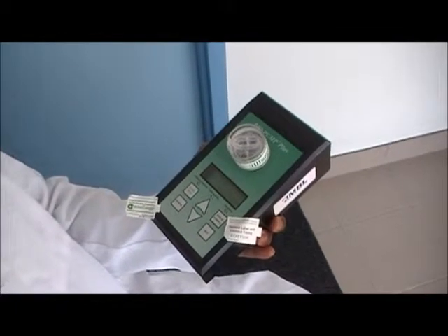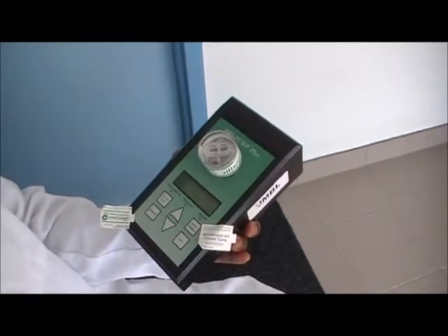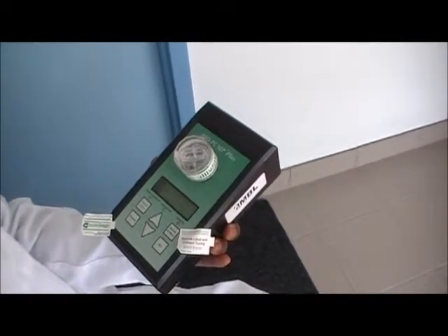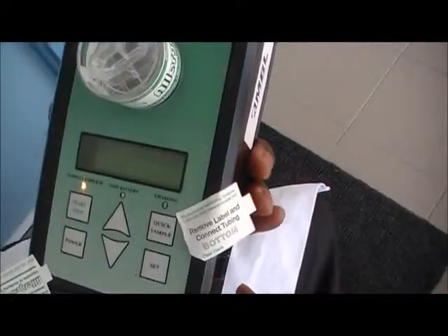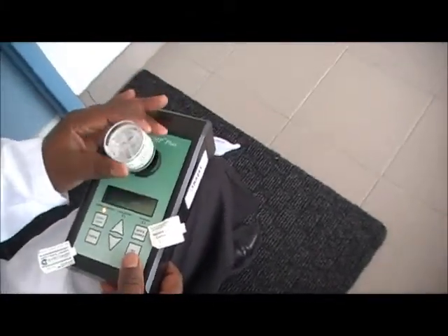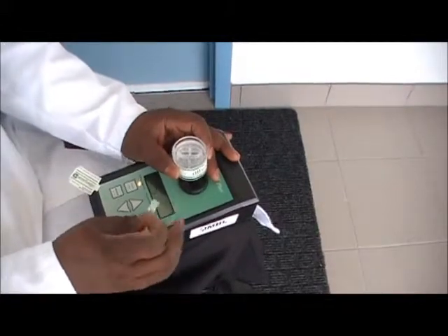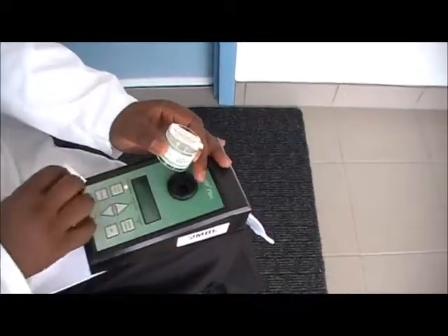All you need to do is remove your sample, replace the stickers, and you are done with that sample. That's very simple. Remember to keep the stickers because you have to replace them after the sample is taken.